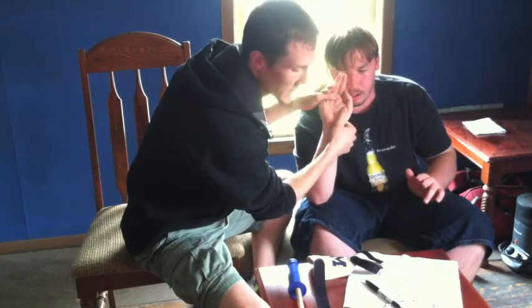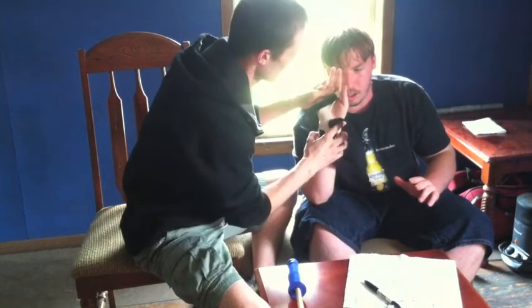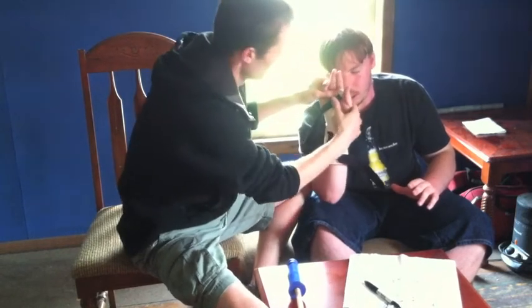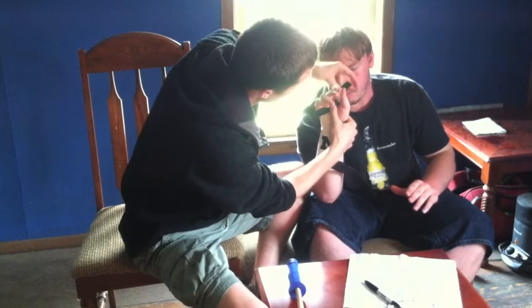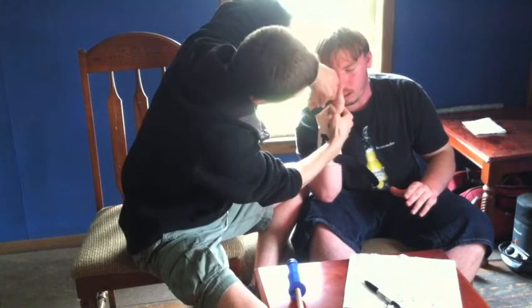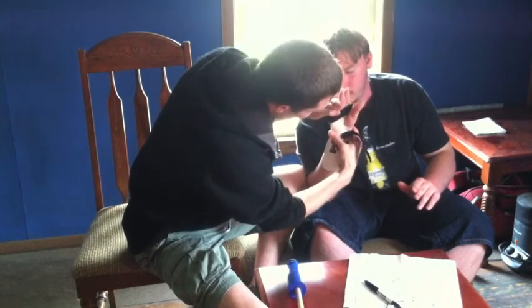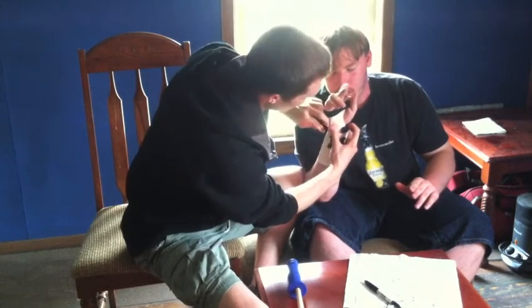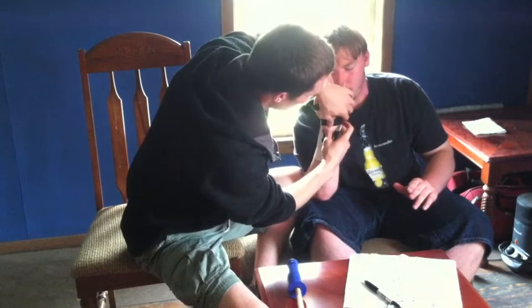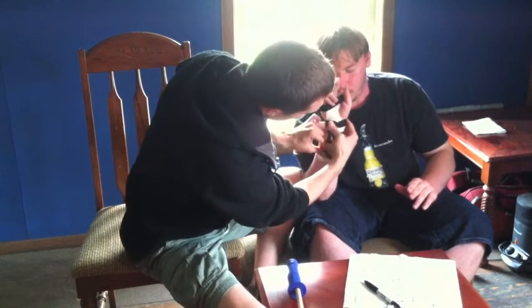So get the hand positioned how we want it here, a little bit more neutral, and also with the fingers extended a bit more. And I found it easiest if we strap up this top part here, if I support the palm right here, the palmar arch. Bring that around because we want it snug here. And this is probably going to be something that Nick will need some help donning or putting on, just from the standpoint that it is pretty snug, and we want it as snug as possible when we're using this.